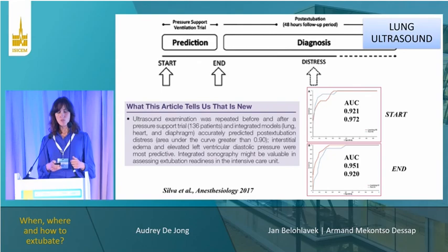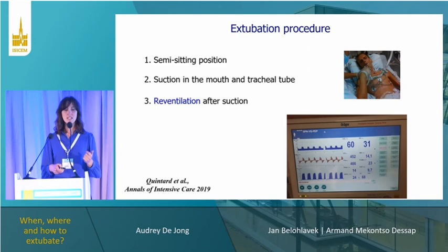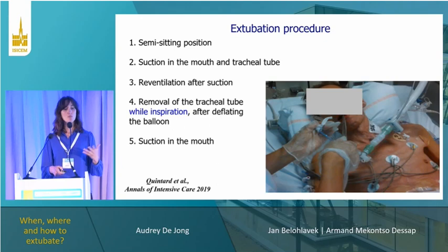So how to extubate in practice? Better in semi-sitting position, better to reventilate after suction to avoid the derecruitment, and then we can remove the tracheal tube during inspiration and, of course, after deflating the balloon.